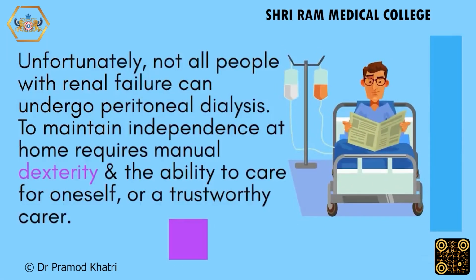Unfortunately, not all people with renal failure can undergo peritoneal dialysis. To maintain independence at home requires manual dexterity and the ability to care for oneself, or a trustworthy carer.